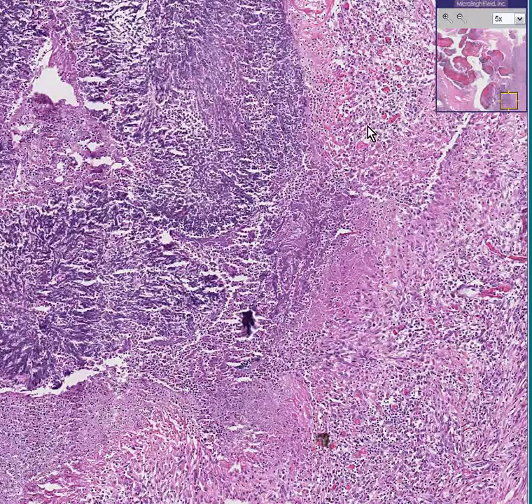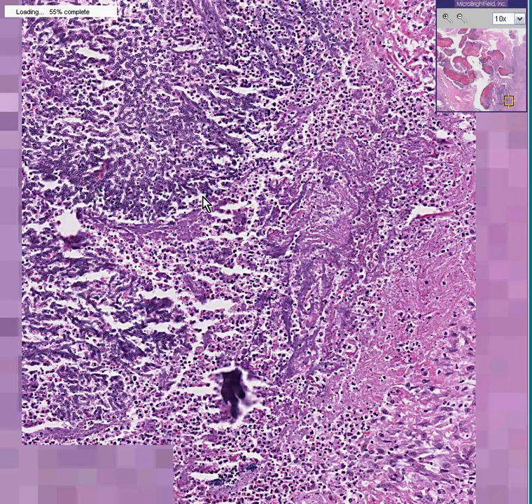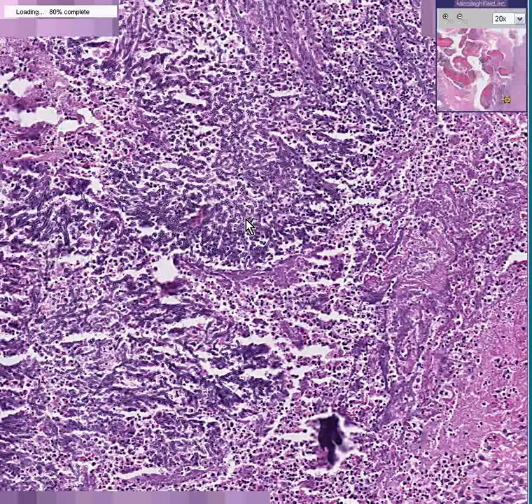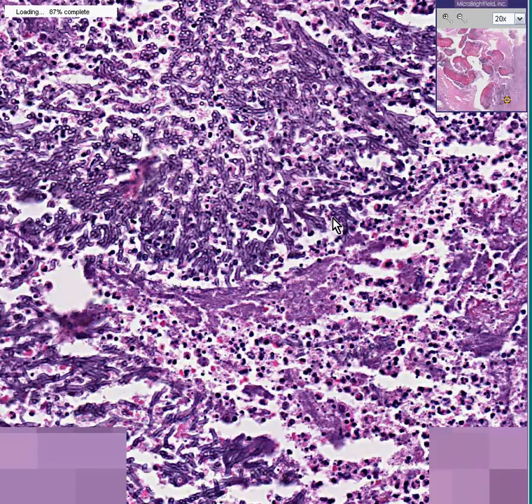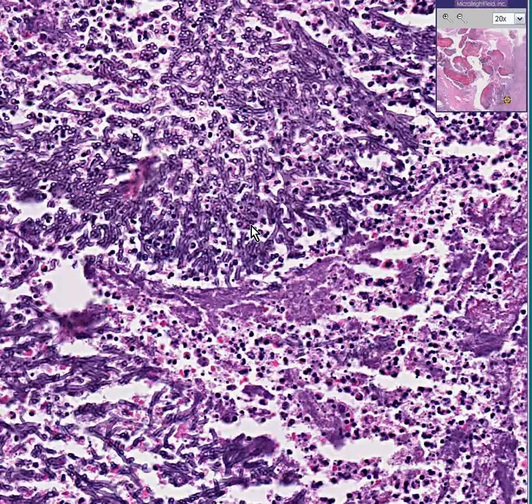When you look a little bit closer at these blacker areas, you can see that they look like they are little branching hairballs again. This is another classic case of Aspergillus pneumonia. Practically every one of those junky, gunky things that we saw in the middle is just loaded with this. It's sometimes called an Aspergilloma, because it can look like a tumor.